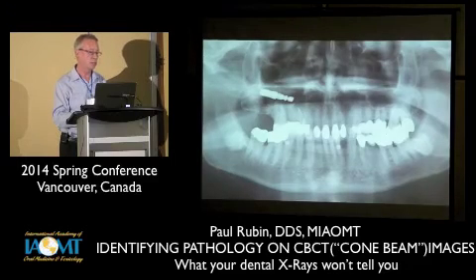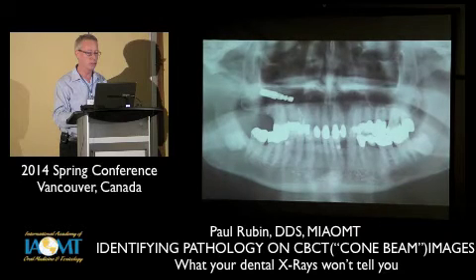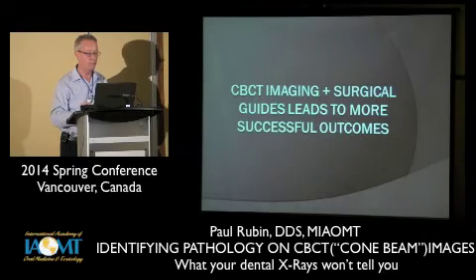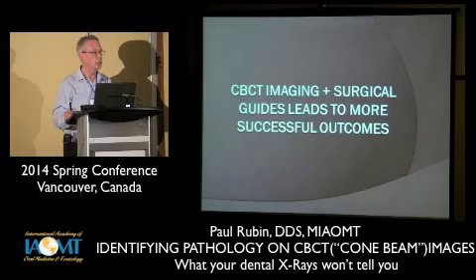Here's one that didn't have such good planning. Obviously, this is the kind of thing you're trying to avoid. So the cone beam image plus the surgical guides leads to more successful outcomes.